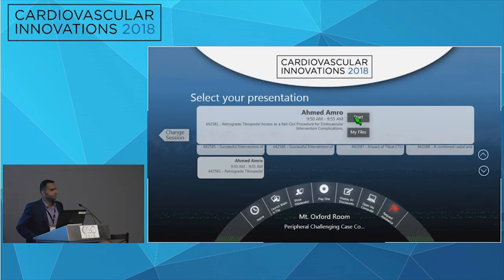I think, especially in light of all the cases we saw today, this is a very good case, again discussing what to do when using the pedal approach, particularly here as a bailout. Did the patient have any symptoms? How much bleeding do you think there was, and how important was that balloon tamponade from the antegrade approach? It was bleeding quite significantly, as shown on the angiogram.